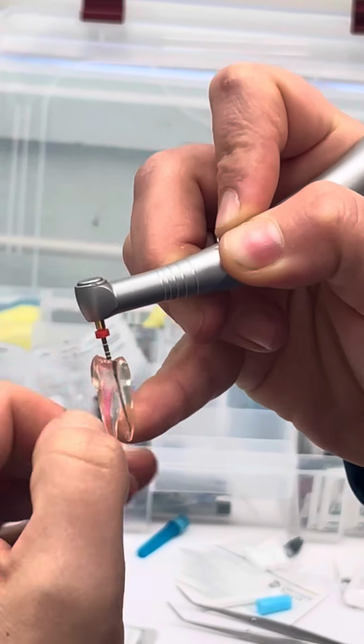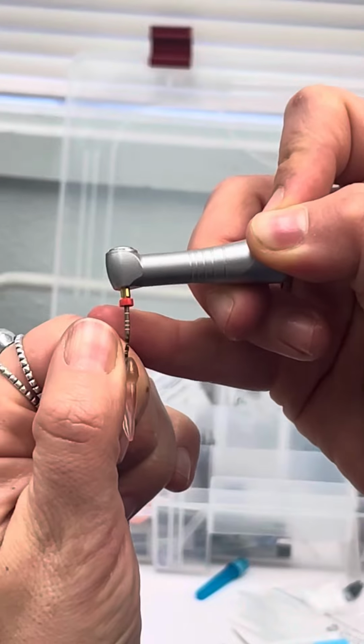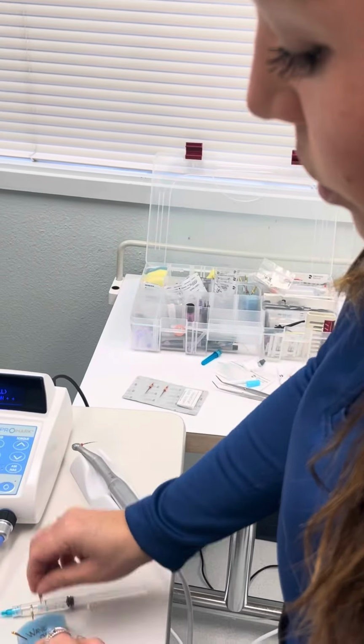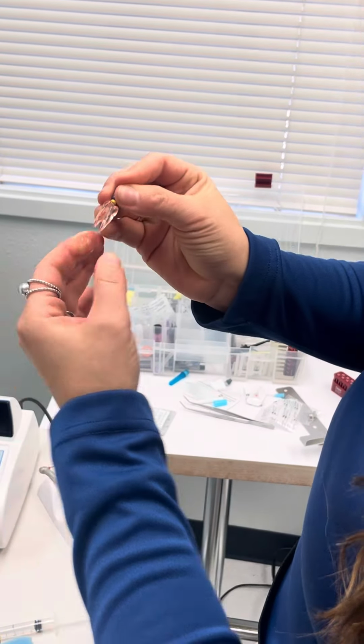Are you able to see that? Oh, it's getting so slippery. Here we're working our way, checking our flutes. Irrigate, recapitulate. Yep, we're getting lots of debris.